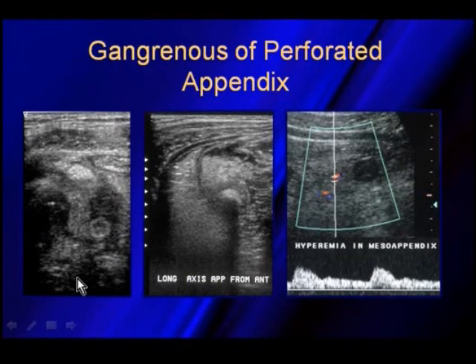So in scanning this patient, when we put the transducer down, we found what I like to call a big Goomba, where you're like, what on earth is going on here? But you can see all of this inflammation within it, and scanning around, we're actually able to find what looked like a short axis view of a normal appendix. But here is the appendicolith, and this is the appendix that has perforated.